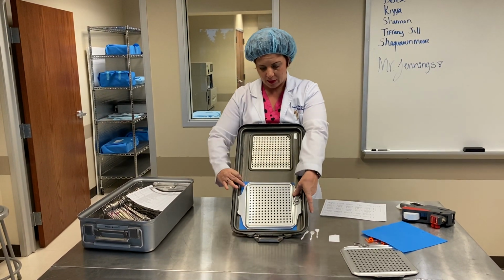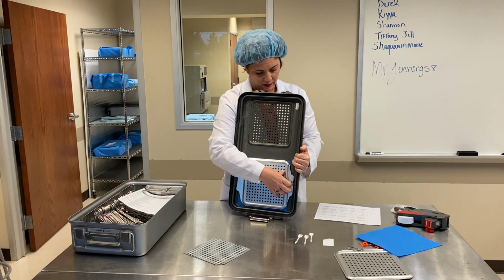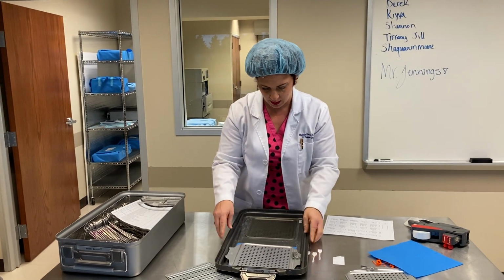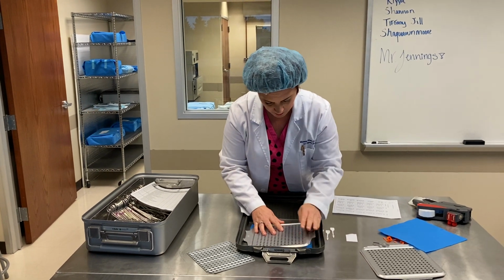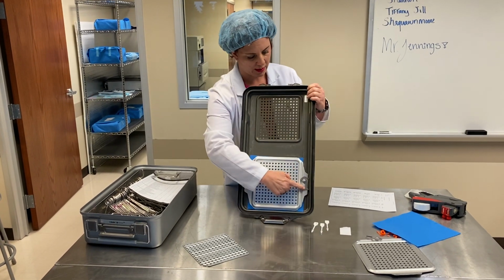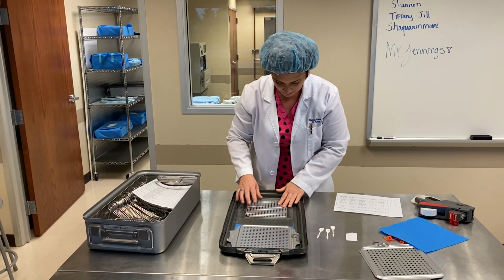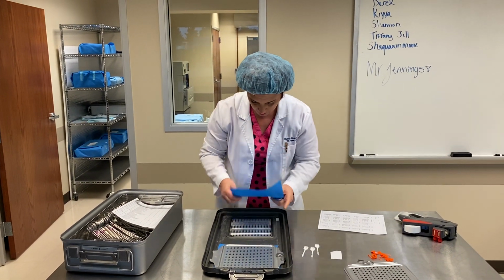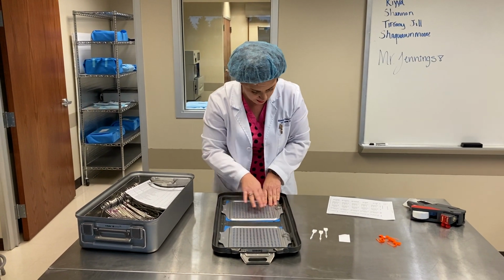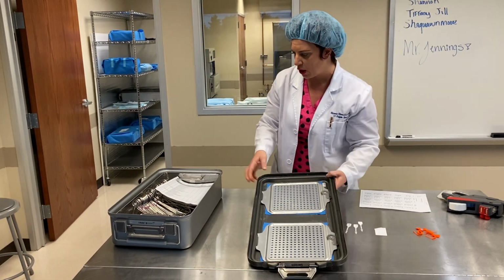Let me hold it up so that you can see that. I think we looked at this before in the lab, but this has to be pushed down and then locked into place there. You can see how I've locked it into place. We'll do that with the other one. Insert this in there, push this down, lock this into place. Okay, so now the lid is ready to go.